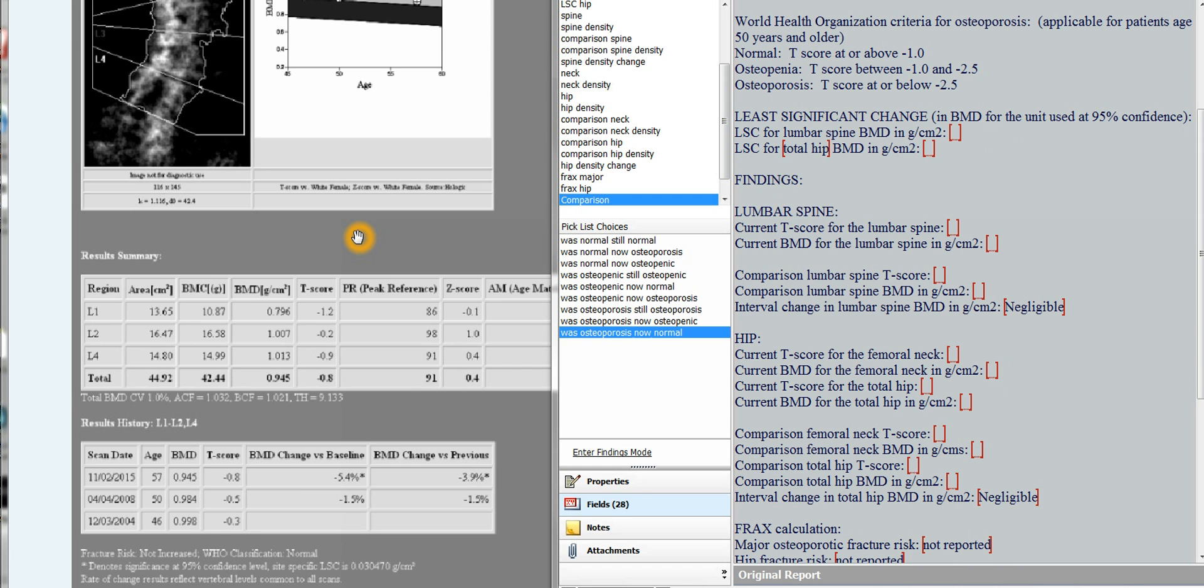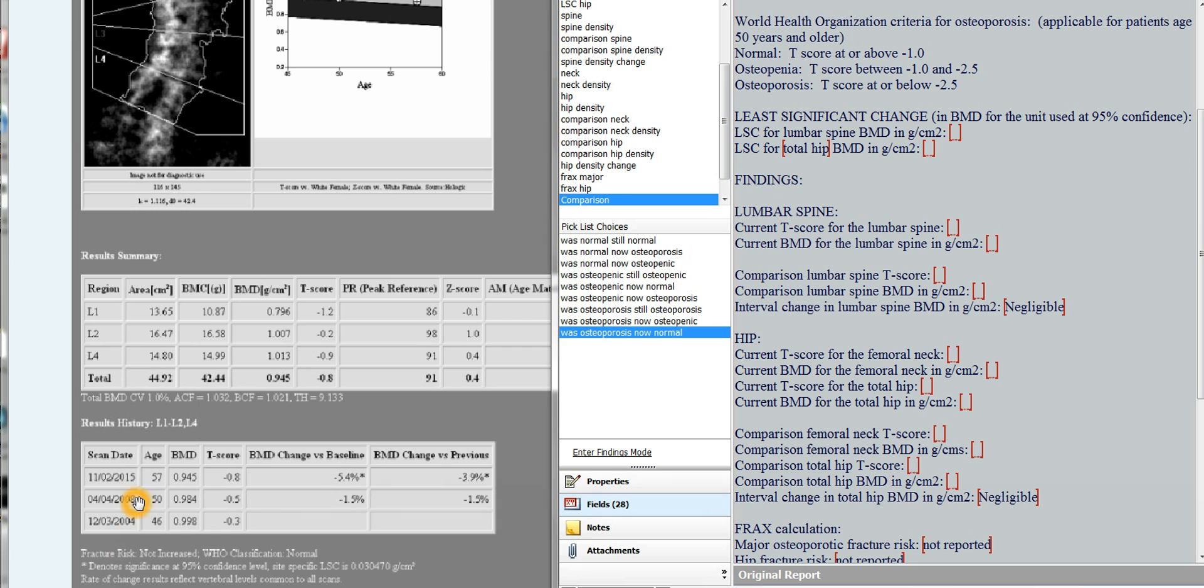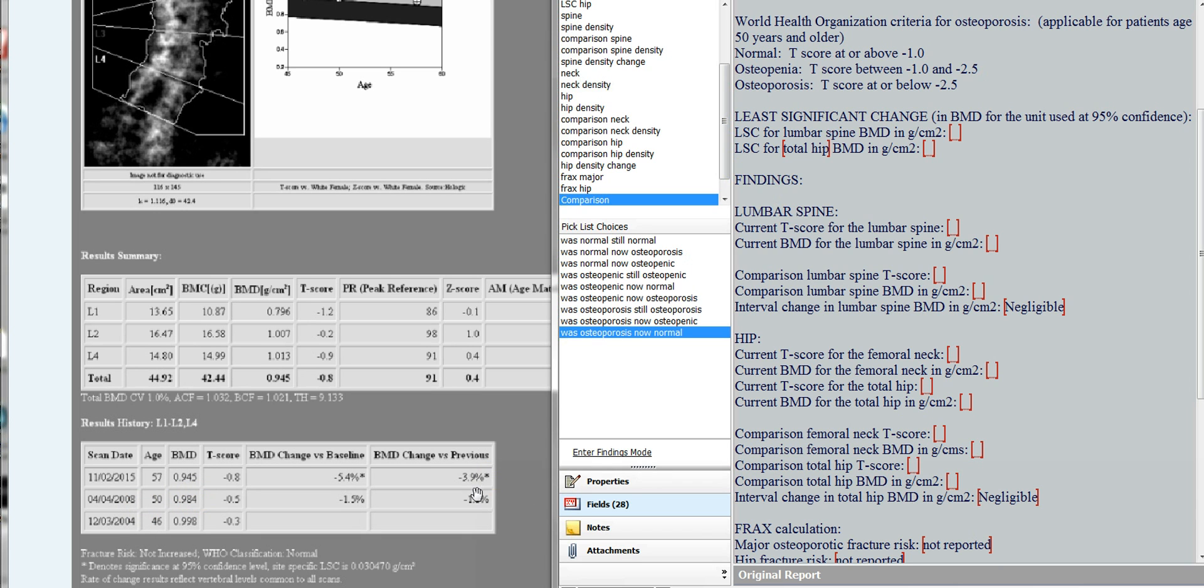First of all, to make a valid comparison, it has to be on the same machine. Both scans have to be on the same machine, and in this case, this is an example of a Hologic. GE looks a little bit different, but the principles are the same. Which scan are you going to compare to? Well, it has to be the same machine to even consider it. And if you have the choice, always compare to the most recent comparison. Patients and clinicians are usually interested in what has happened since the most recent scan. So don't go back to the baseline, just compare to the most recent old comparison scan.